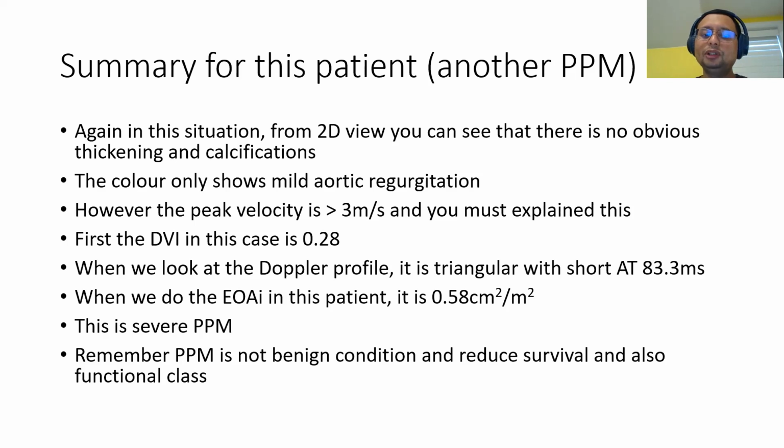Okay, patient prosthesis mismatch is not a benign condition. It reduces survival and reduces functional class. There are times when, even with a normal valve and patient prosthesis mismatch, they are symptomatic. We operate on them and we replace the valve.